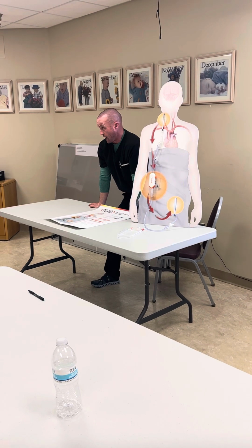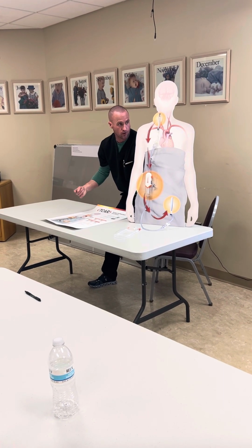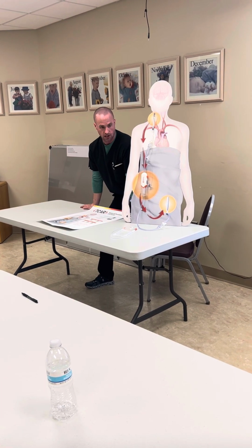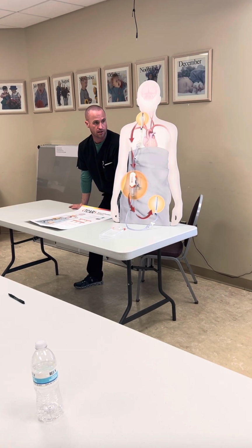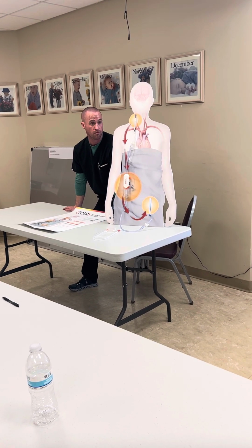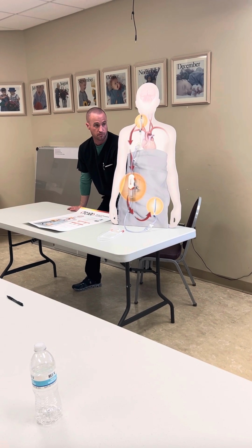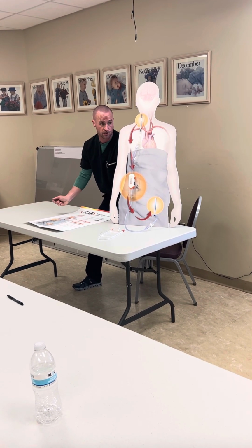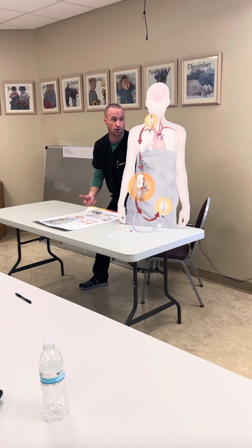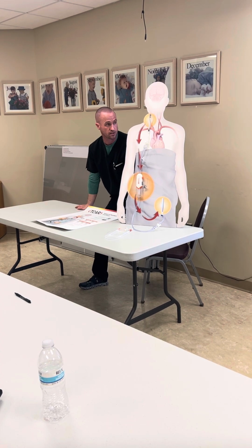I always just say it's a vascular tray. You want 90 degree, right angles. You want hemostats, DeBakey's. You want a couple different types of clamps. Profunda and maybe a DeBakey clamp, umbilical tape. Again, additional stuff that we don't usually have open is an inflation device for the balloon. We do several 2-0 silks, and that's just so you can suture the sheaths in place, right? Just stitch in place, that way it doesn't move on you.